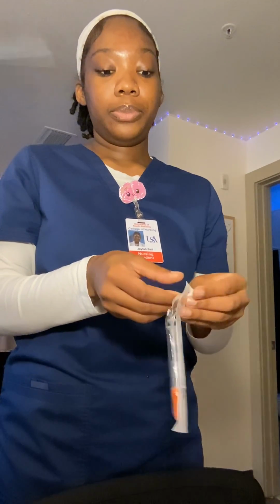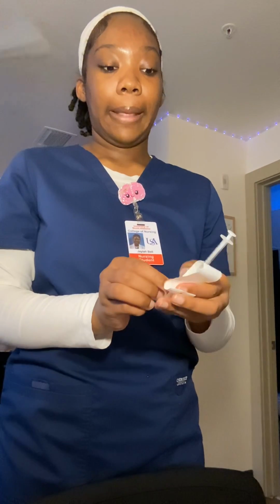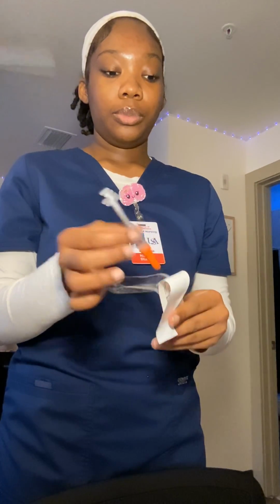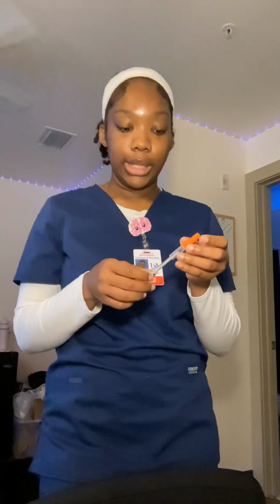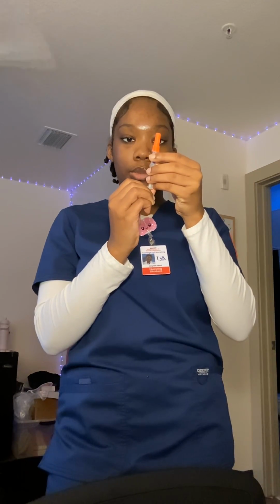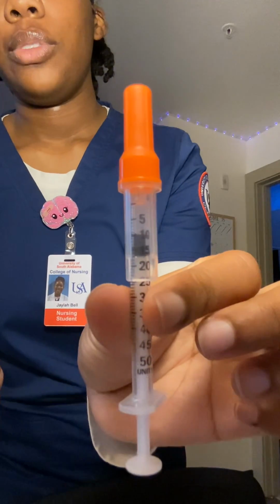Open this up. First, I'm going to draw back 10 units of air. I do have that 10 units of air in there. Y'all can see that. Okay.